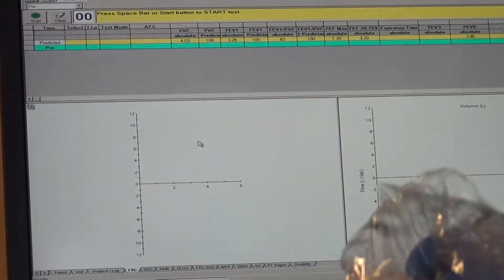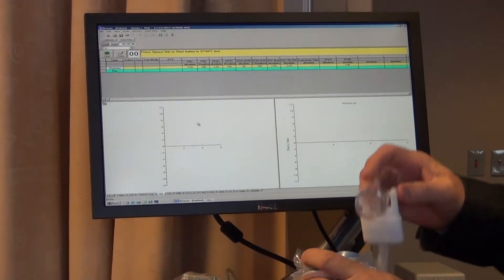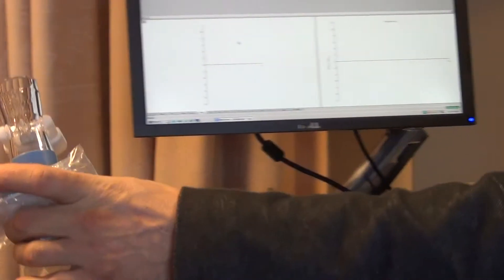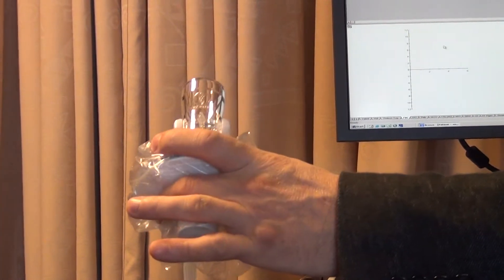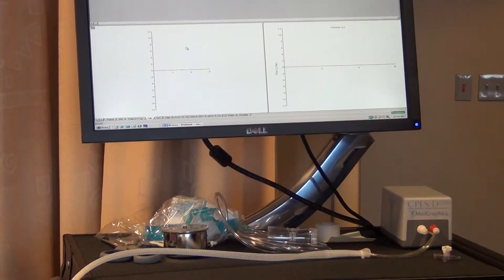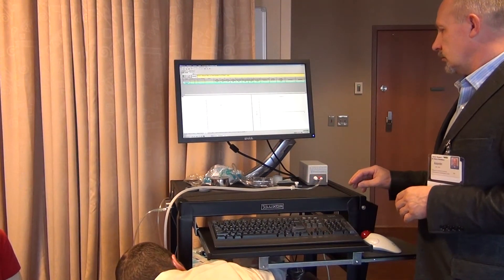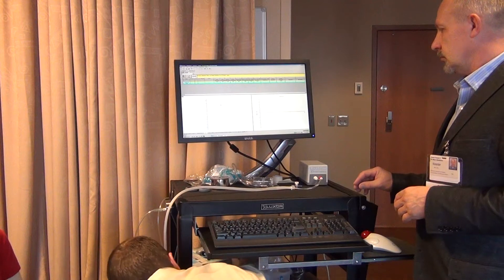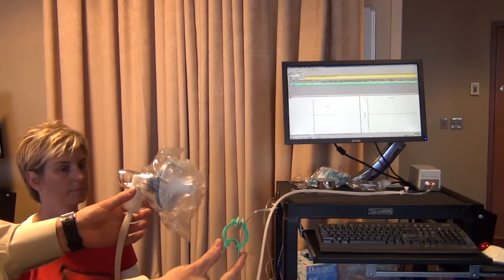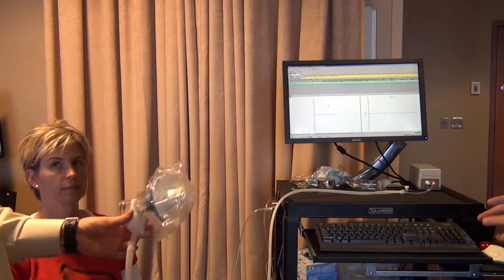Now take the mouthpiece filter and plug the blue side into the pneumotach. We also need a nose clip and this setup right here. And we're ready to begin the test.